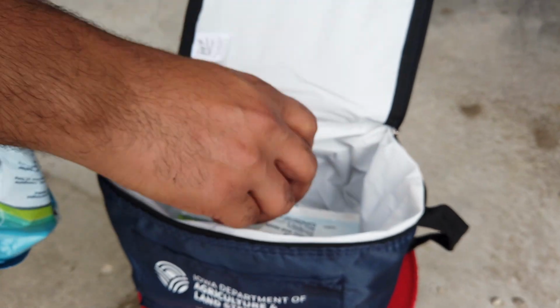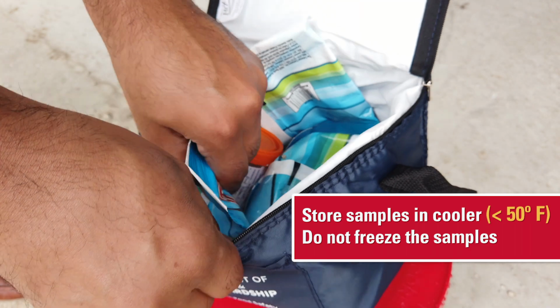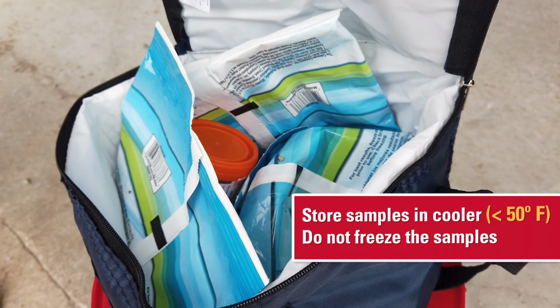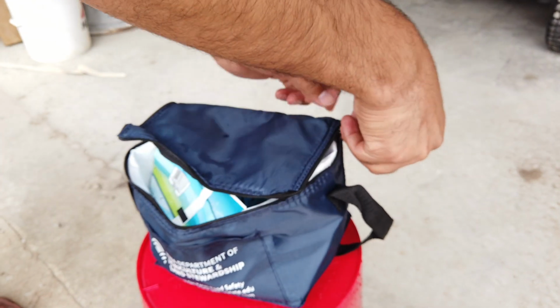Store the samples in a cooler at less than 50 degrees Fahrenheit and record the time of sampling. Do not freeze the samples. Most labs will have time frames between sampling and testing to adhere to. Generally, it is required for the sample to arrive at the lab within 6 hours of taking it.